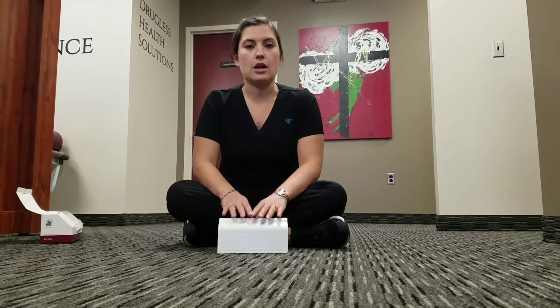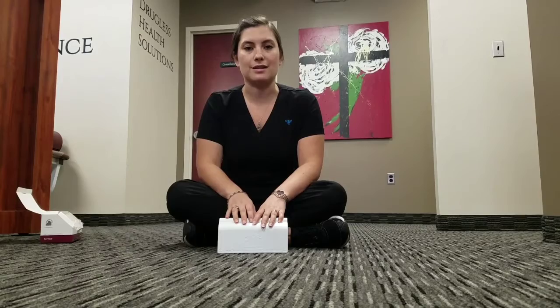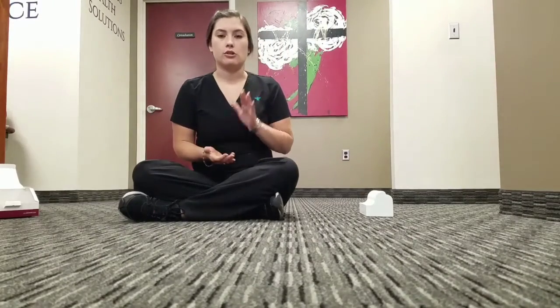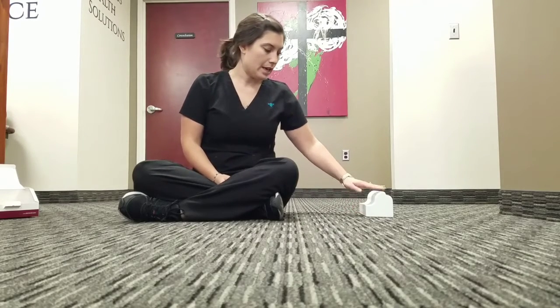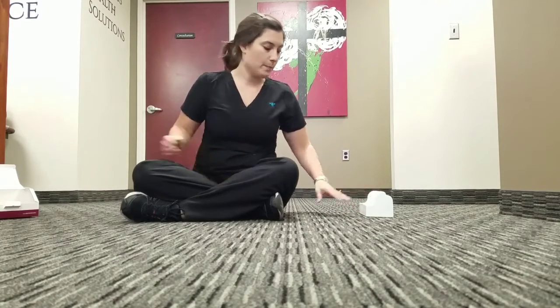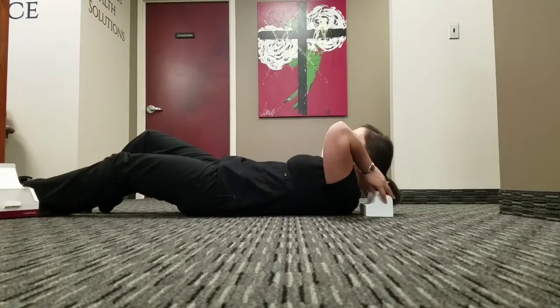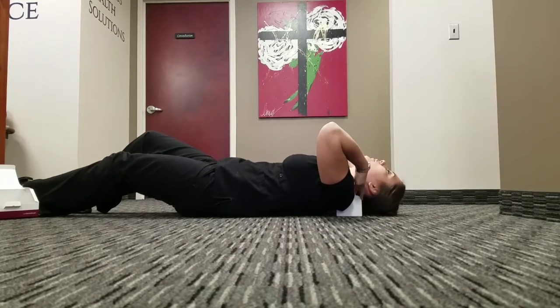So as long as it's not causing any increased soreness or discomfort, you can move up to the next level. Okay, so if you're doing this on your lower neck, you're going to place this down. Remember, your shoulders are going to be on this side, and your neck is going to go over this top portion. So you're going to lay back. And it's helpful to have a spotter with you the first time you do it, just to make sure that you're lined up the way you should.